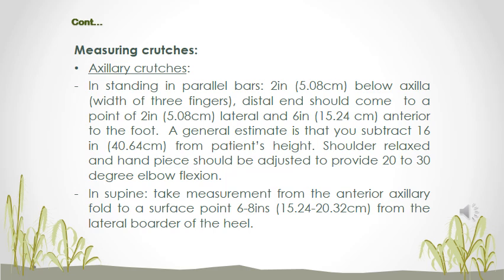In standing, for instance in parallel bars, take the following measurements. Five centimeters below the axilla, 3 fingers width, that is how much space should be between the axillary fold and the top of the crutch.